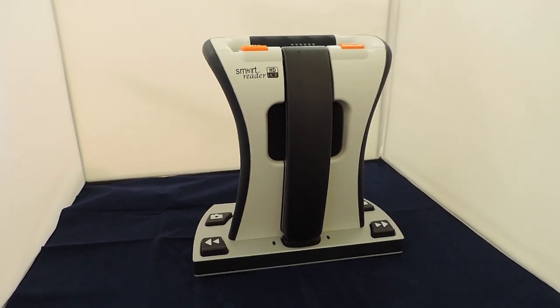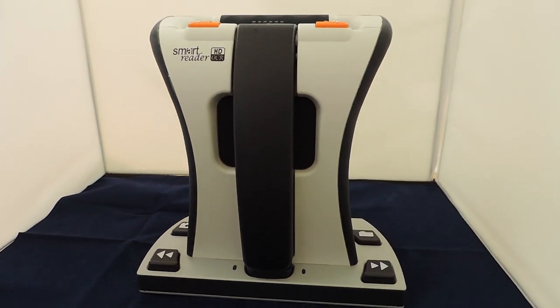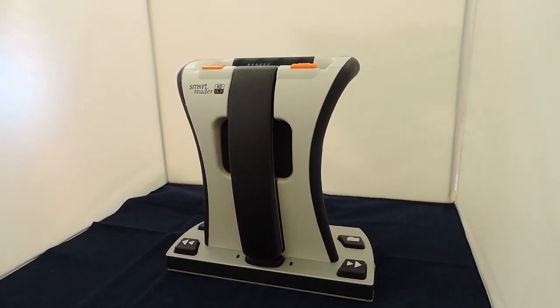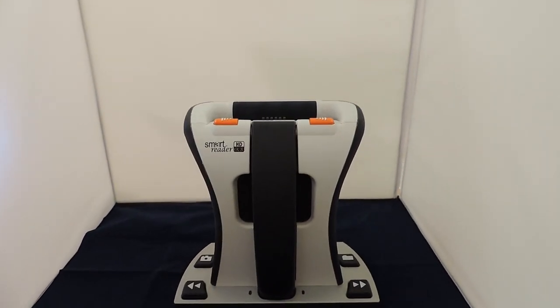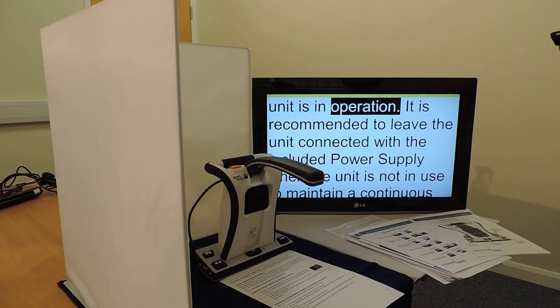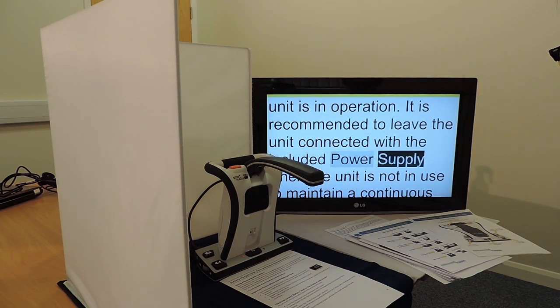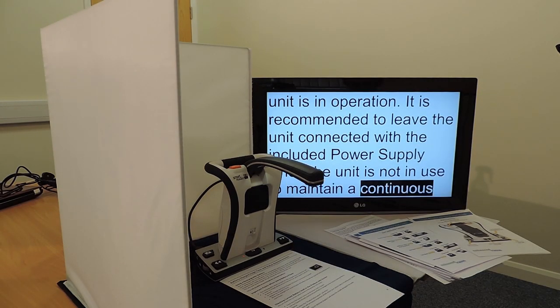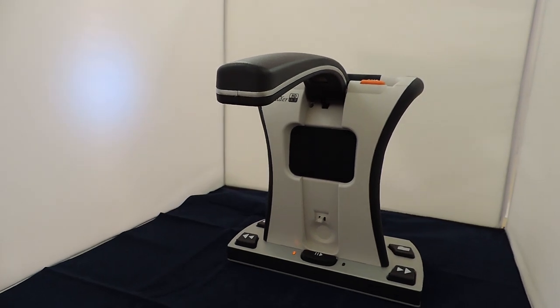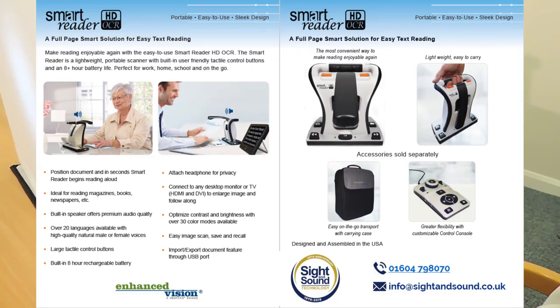The Smart Reader HD is a lightweight portable reader scanner with large built-in user-friendly tactile control buttons. A fully integrated solution, the Smart Reader HD offers the advantage of a built-in HD camera and OCR, or optical character recognition. It enables individuals with low vision to retain the pleasure of reading by listening along or by attaching a monitor to view the text. Users are able to view in colour, enhanced high contrast positive or negative modes, allowing for higher contrasts and easier viewing. With easy to use buttons and dials, customers can enlarge or reduce the text in seconds and change viewing options for easier visibility.